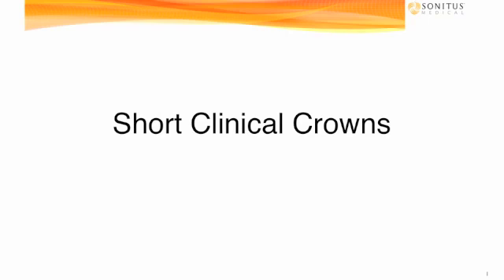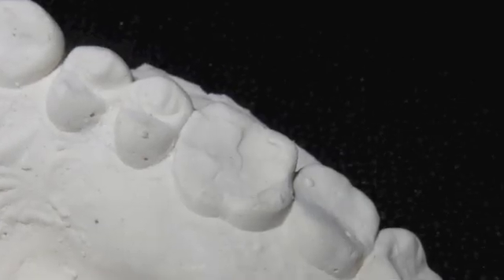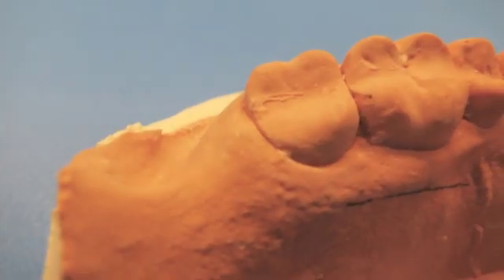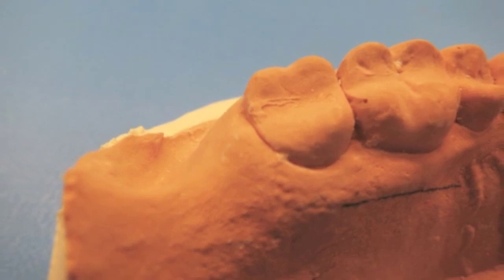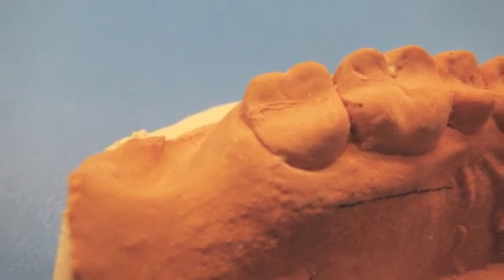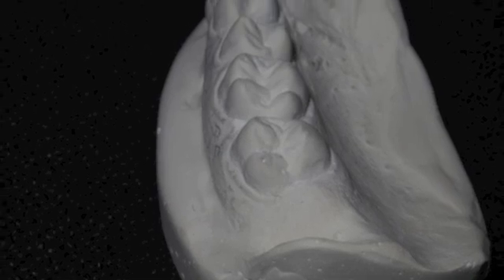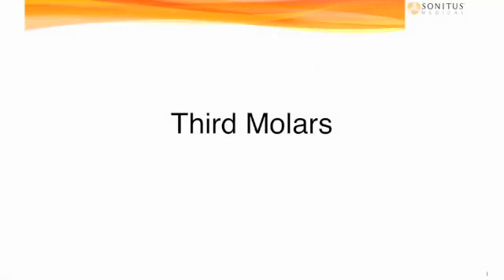Let's talk about short clinical crowns. Short clinical crowns interfere with the retention of our device. We require the lingual side, we get retention from there. And if the crowns are very short, potentially the patient might have occlusal issues where they hit the device, or simply it's very loose. So watch out for short clinical crowns.